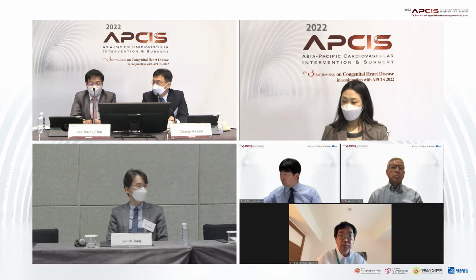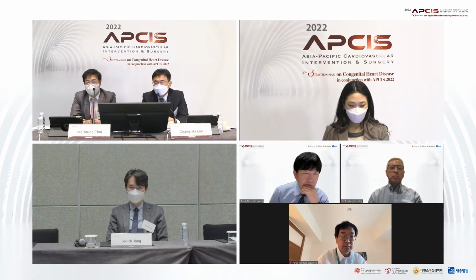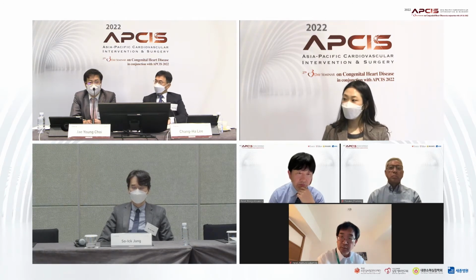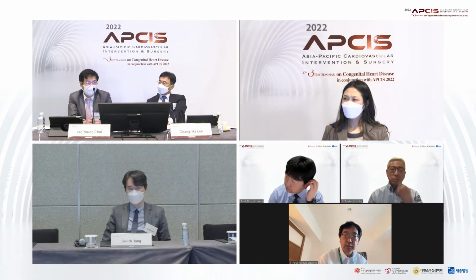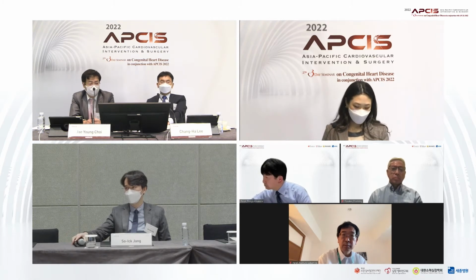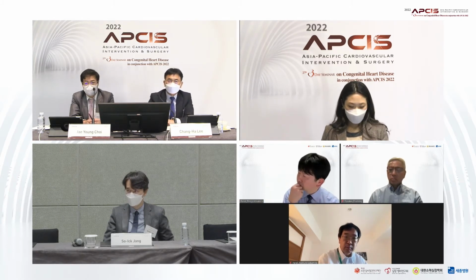Okay, I agree. However, tortuous itself is not a contraindication because we can straighten the PDA. So the PDA course could be quite different after the stent placement. Of course, in this very complex PDA, maybe different from the usual decision making, but in most of the cases, I would like to emphasize that would be one of the treatment options.